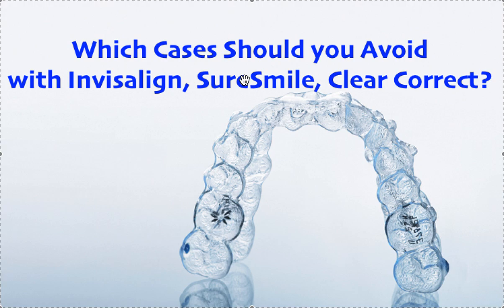Now, that being said, you can take other aligner systems like SureSmile, Reveal, White Label, Global, ClearCorrect, and marry them with a lot of cool orthodontic appliances, which are readily available from any orthodontic lab. Your Ollendorf's, your Specialties, your The Orthodontic Labs, your John's Lab, Gergen's Lab, they're all very nice people. You can use some appliances first for a few months, fix that more complicated issue, and then go into an easier, cheaper system. So there are definitely workarounds, so you don't have to use Invisalign if you have an issue with it, or you don't have the scanner, or you just vehemently are opposed to supporting Align Technology.